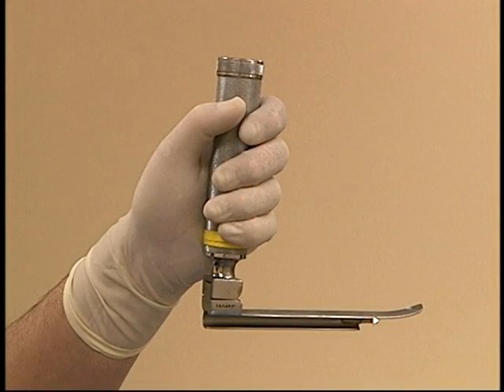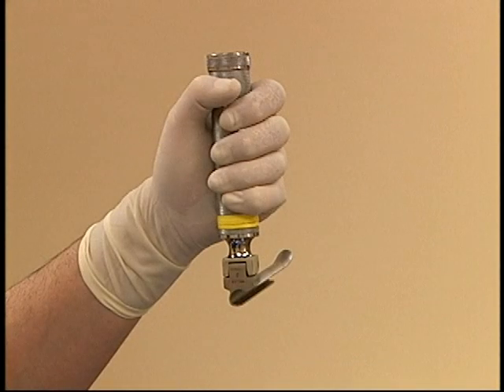The laryngoscope should be used to avoid stimulation of the larynx, which may cause laryngospasm and increased vagal input. The laryngoscope is designed to be used with the handle held upwards to intubate patients in dorsal recumbency, and sight along the blade.